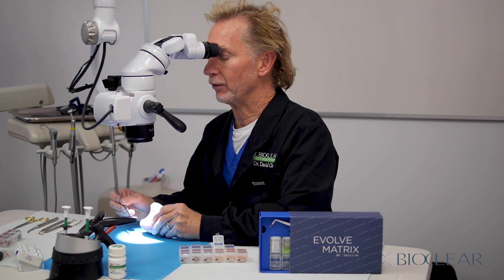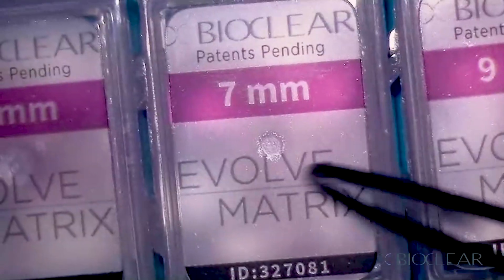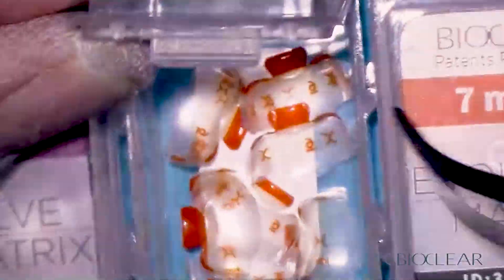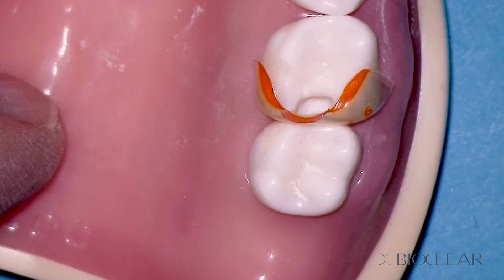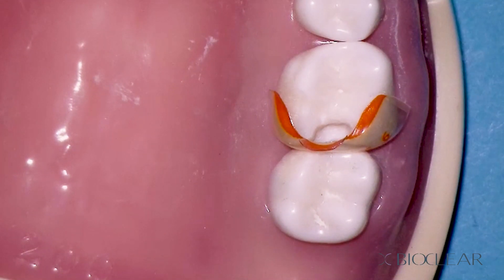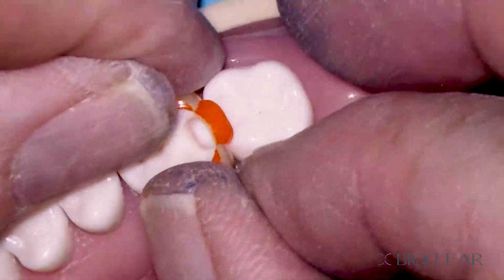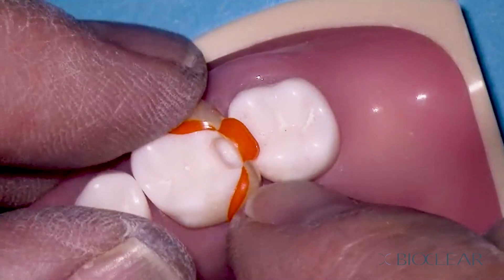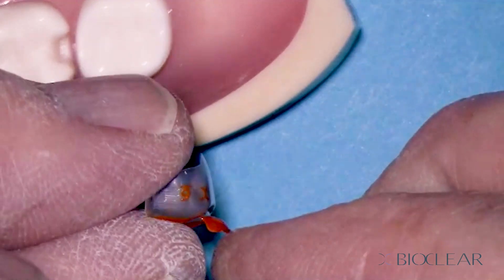In a case like this, instead of using the blue, we want a flatter emergence profile. All of the Bioclear matrices are color coded for emergence profile. So instead of the aggressive blue, we're going to use a flatter orange — or even flatter pink — emergence profile, just like we do with the black triangle kit. Let's grab a six millimeter orange Evolve, since we gauged the cavity at four millimeters. Driving this matrix in, you can see that is a much better choice. It's a much flatter matrix and it's not inverting. It's a little tight because this is a large molar, but that would do.